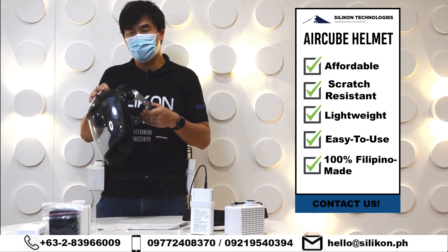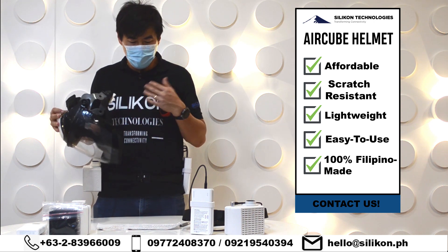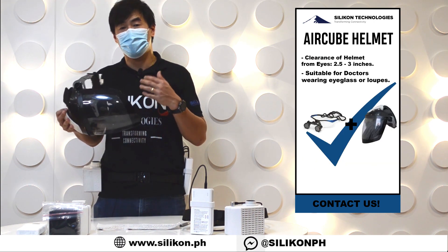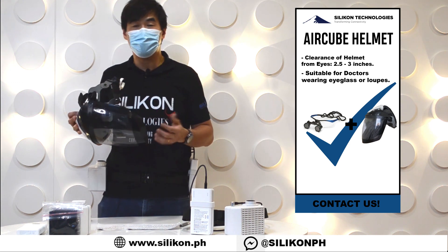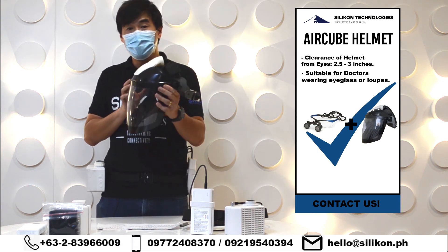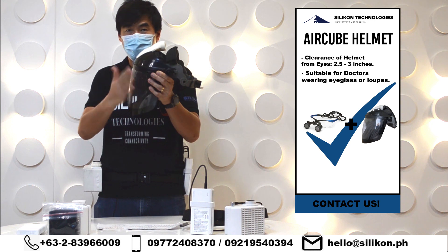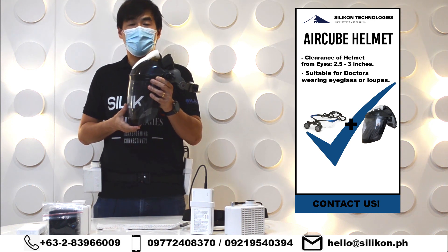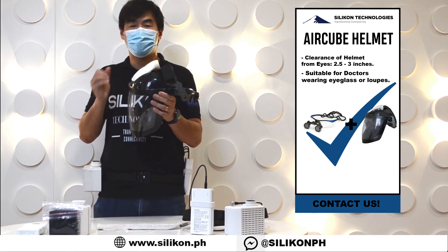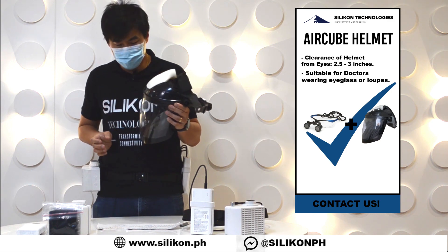In terms of the design itself, since this is a loose-fitting face piece type of design, you can still use your glasses, and if you're wearing loupes you can also use your loupes. The clearance of the polycarbonate from your eyes is around 2.5 to 3 inches, which has a bit more clearance compared to our hoods, which only have around two and a quarter inches of clearance.